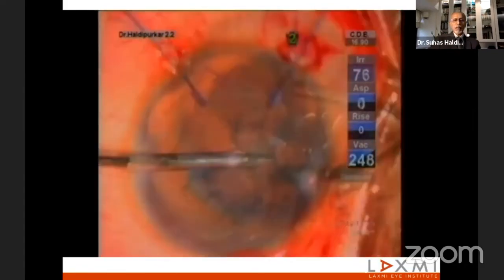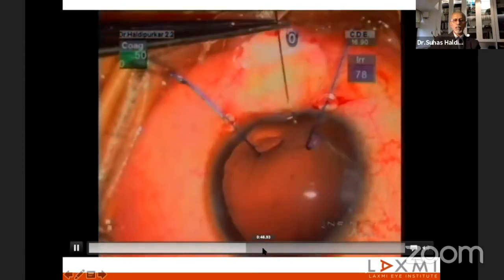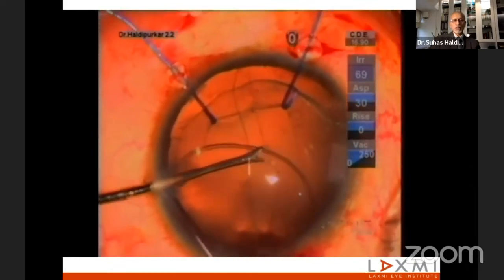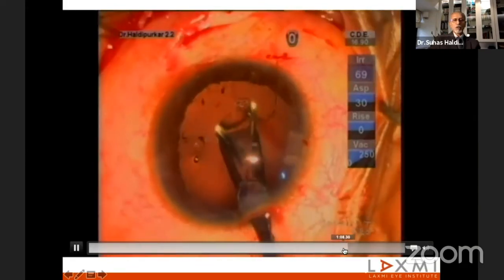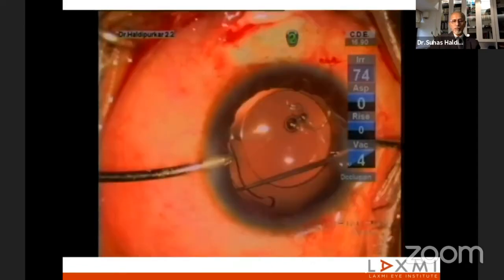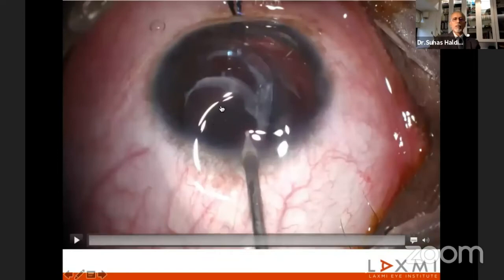And then subsequently, when we knew about pupilloplasty, I did try and convince him, but somehow he wasn't very convinced because he had no issue with glare. And so when the lens was put, he still continued to have a large dilated pupil. And then he comes 13 years later with the lens decentered.